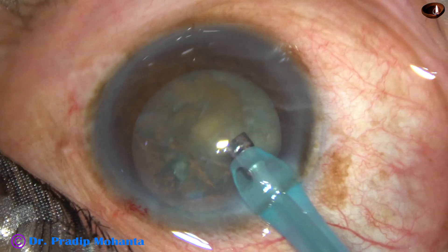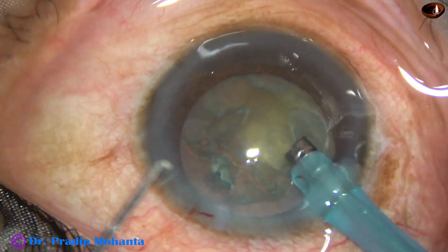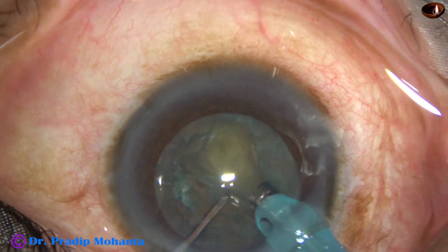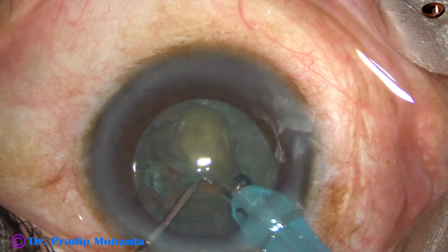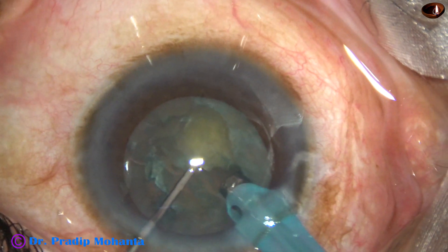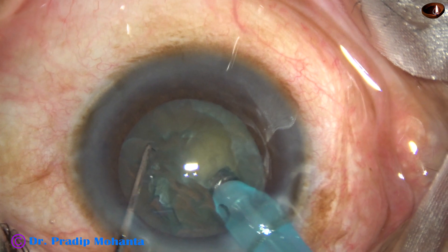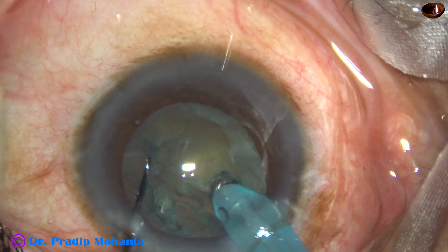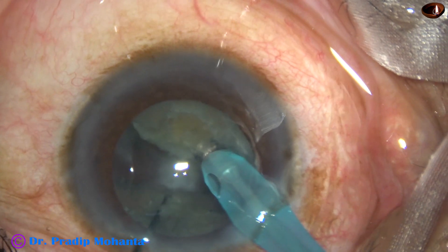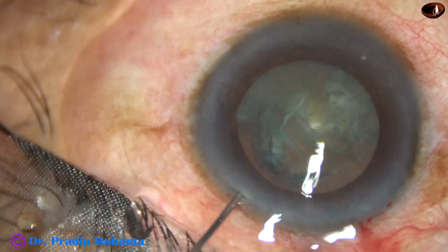The handpiece has been turned — the bevel is up now. A small but deep pit is being made just in front of the main incision. Here it is; this is sculpting. At this time, the vacuum is less. The tip is at the bottom of the pit, and it supports the lens mass in front. The chopper divides the nucleus into two halves. Now let us see this in real time.